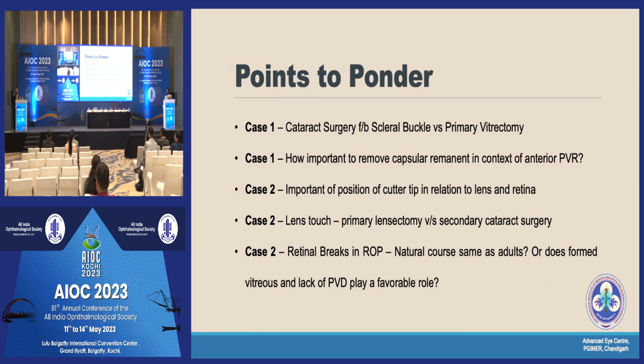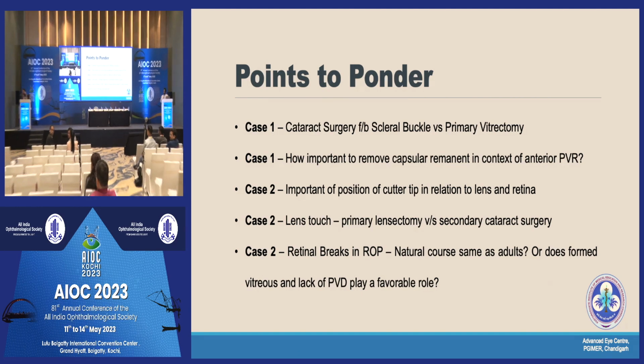Thank you, Simar. Question from you, Aishi. And don't chase the break, don't remove the hyaloid, don't drain through it, leave it. Absolutely. Everything that you would do in an adult is not to be done here. Yes. So thank you, sir.